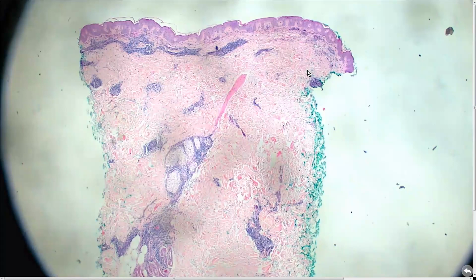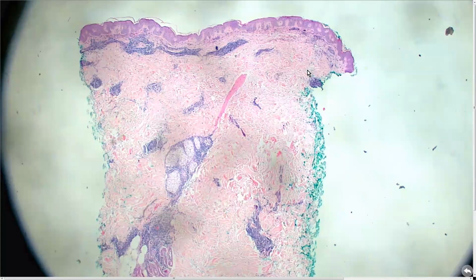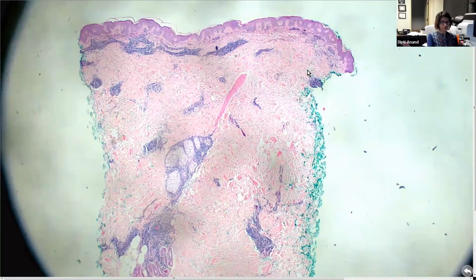Now, for a bug bite with eosinophils, and for all the other entities like lichen striatus, PLEVA, polymorphous light eruption that we talked about, the epidermis has to be affected. And for tumid lupus and EAC, there should be no epidermal involvement. Got it. And between the two, tumid lupus has mucin and EAC does not have mucin. But I have to tell you, this pattern, just by looking at it in low power.